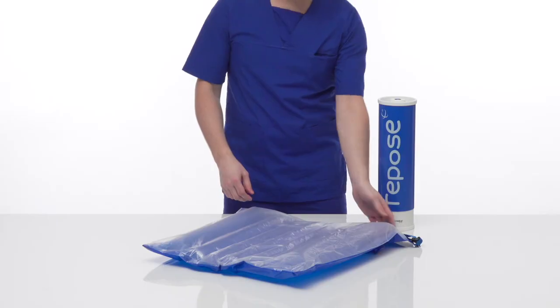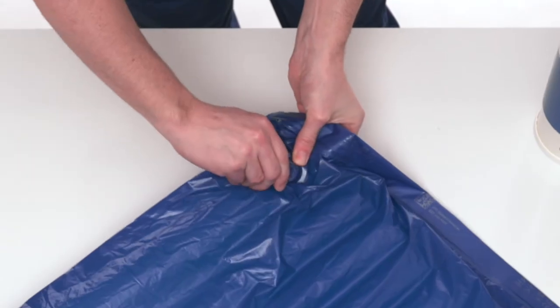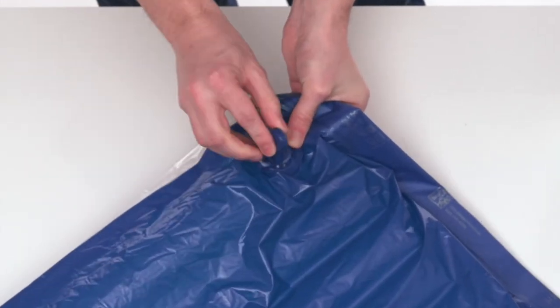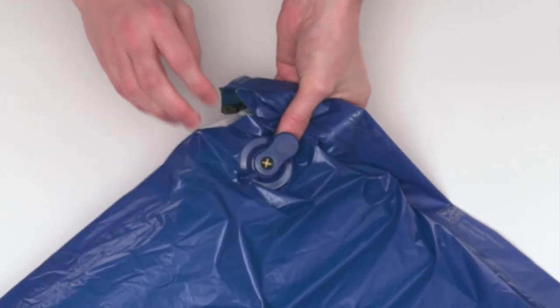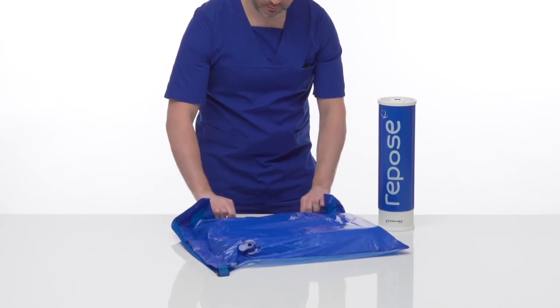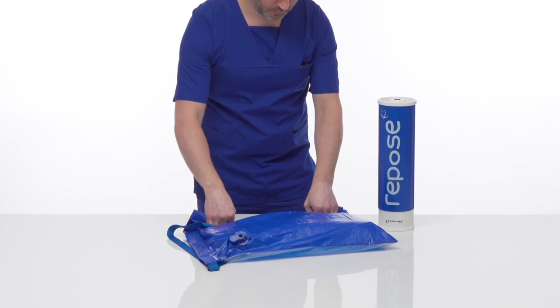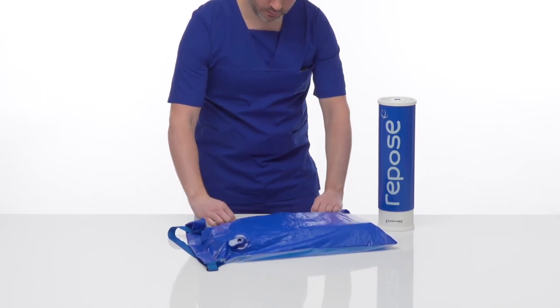With the patient off Repose, detach from the mattress, chair or footboard. Insert the open end of the sealing cap into the Repose valve, allowing air to escape. Once deflated, with the cap still in place, roll up Repose, starting at the point furthest away from the valve, expelling any remaining air.